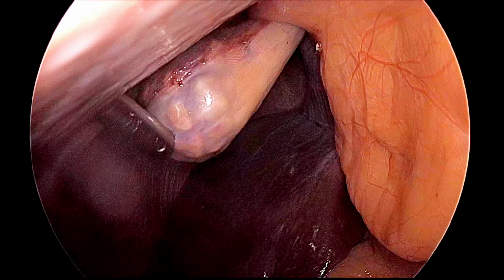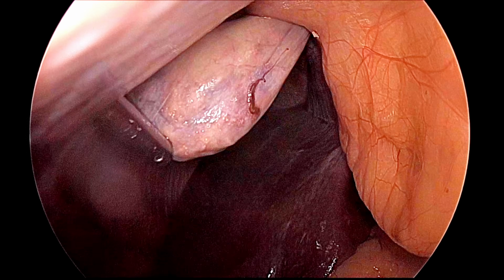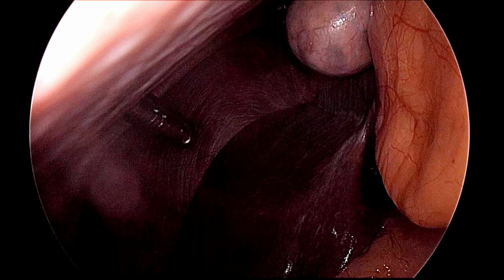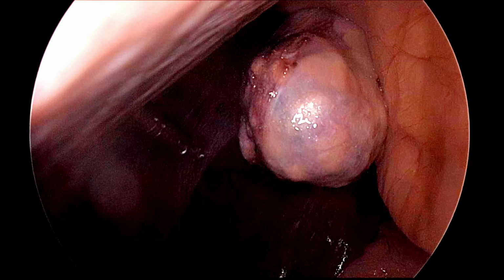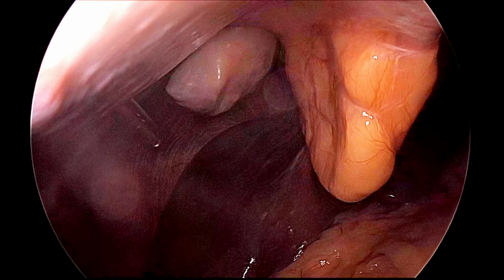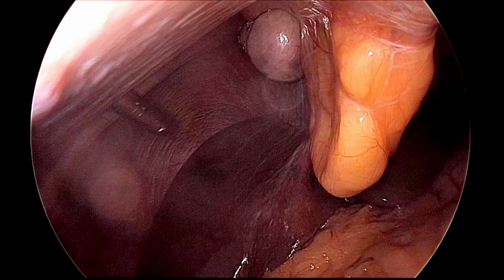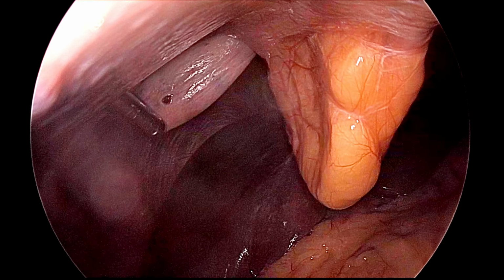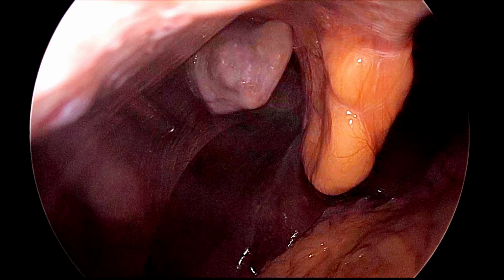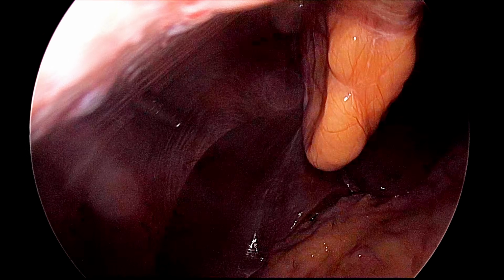Alternatively, you can use an endo bag, but this is a very young patient, and in this we are not using an endo bag. There is no suspicion of malignancy, and it is not an acute case, so there is no inflammation or infection. So here without an endo bag we are evacuating the gallbladder stones, and then the gallbladder will be easily taken out. We can see now all the stones are pulled out one by one, and once it becomes empty, then easily you can pull it out through the 10 mm wound.